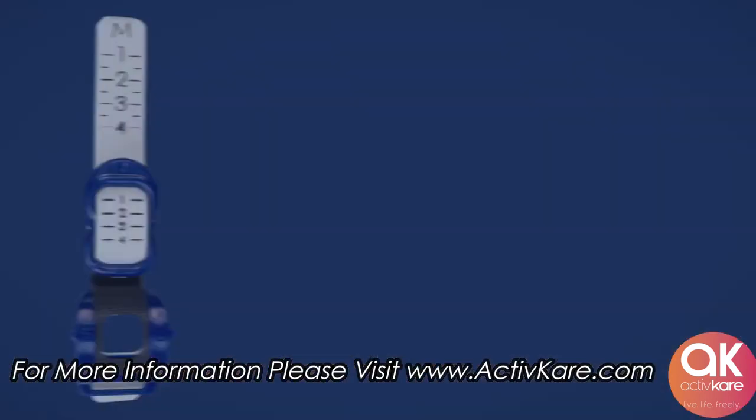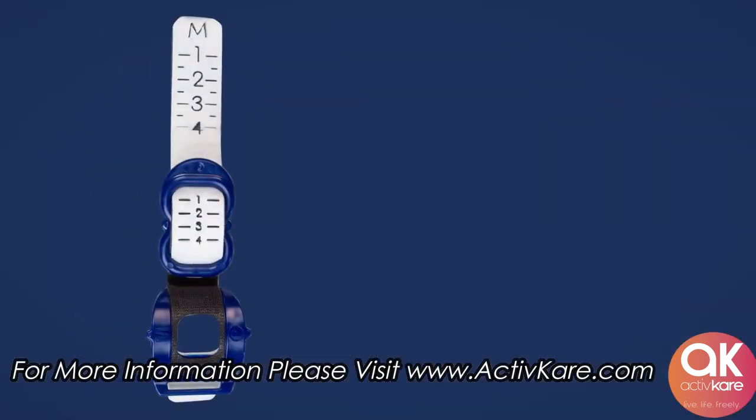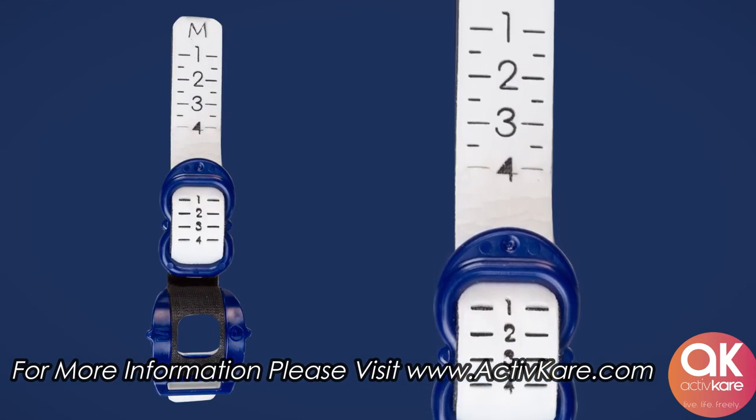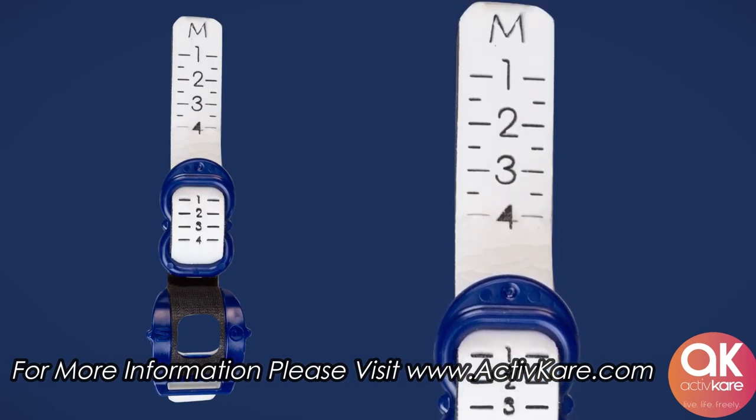The Velcro strap has numbers cut into the strap so that you can find the number that works best for you. Remember that number and use it each time you use the Pacey Cuff.